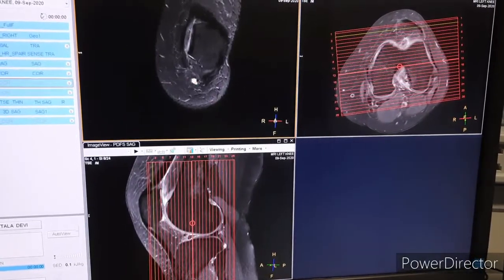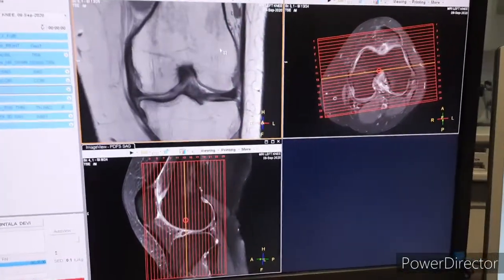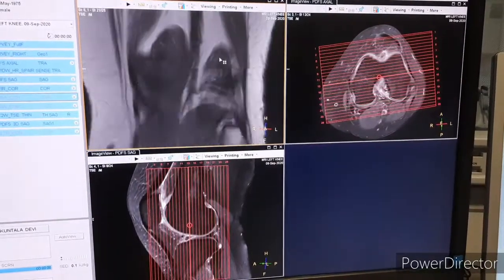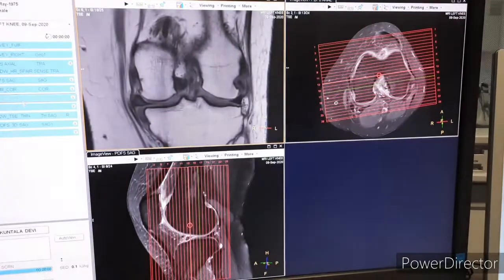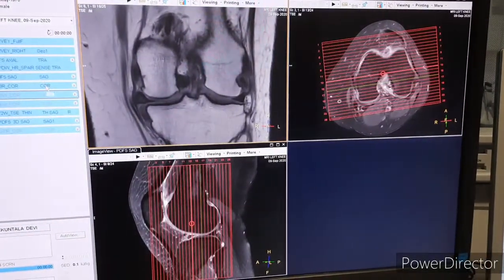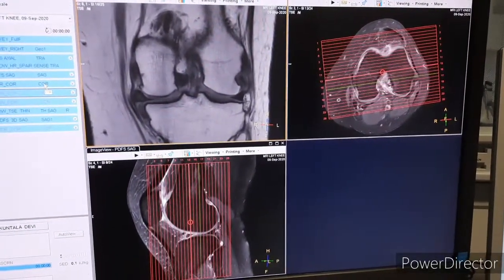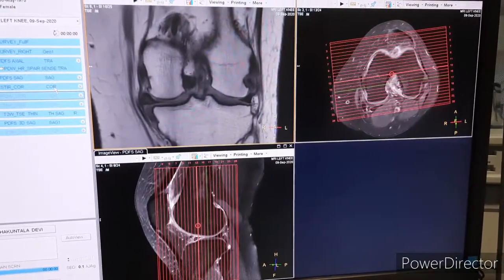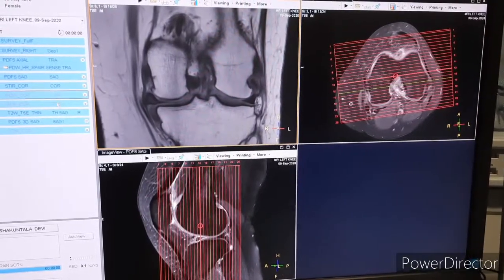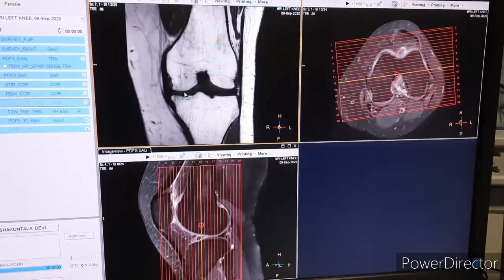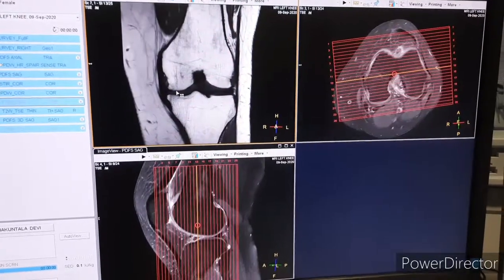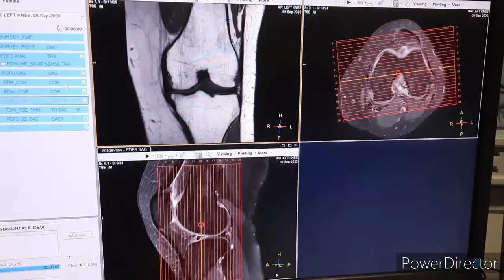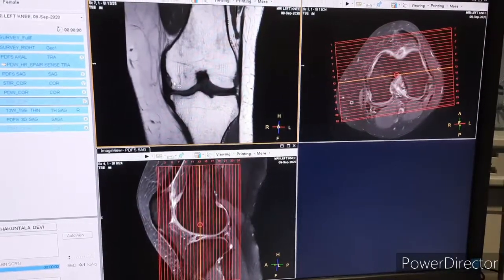Next is PD-weighted coronal — this is non-fat saturated. The planning of every coronal is propagated here. This is a Philips 3T MRI, so planning of one coronal is propagated to another coronal. Whenever you are taking the next coronal it is automatically copied. So the next T1 coronal is copied from the STIR coronal, so you don't have to plan again.